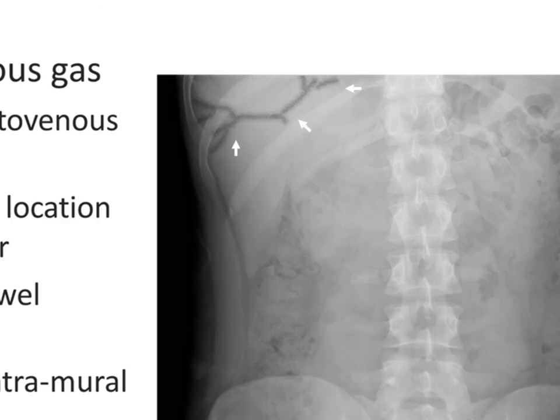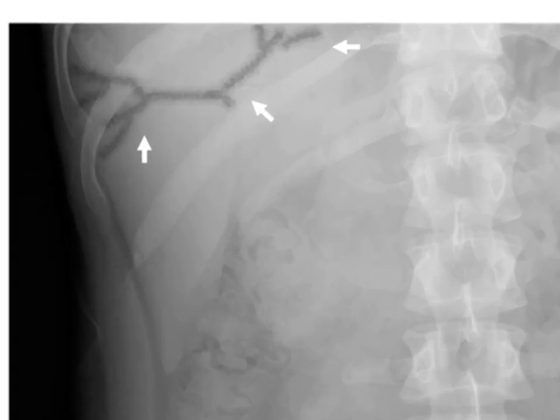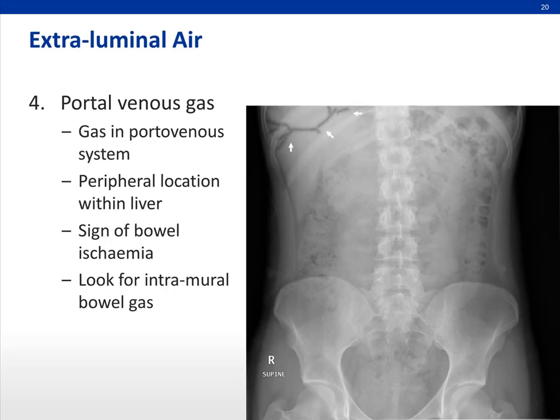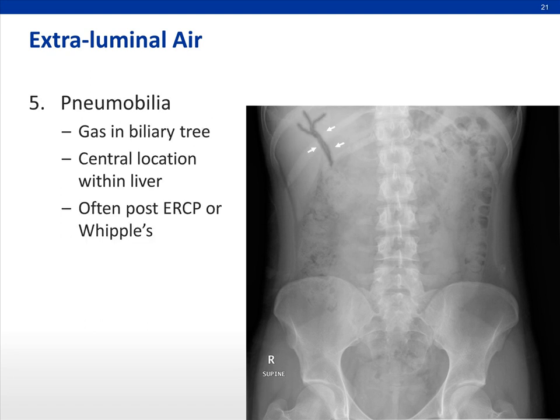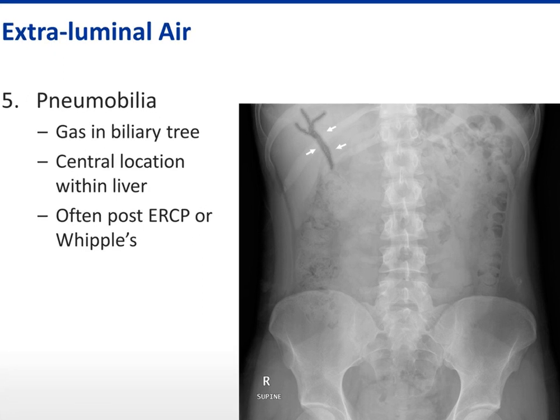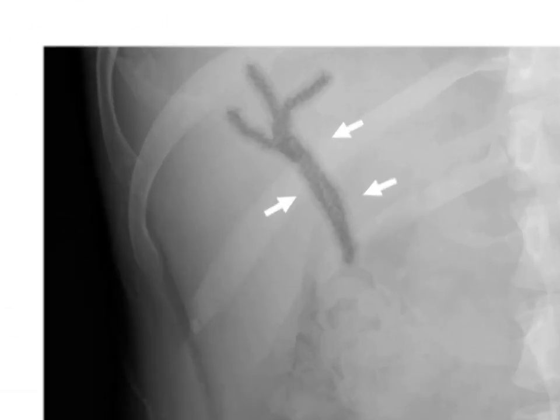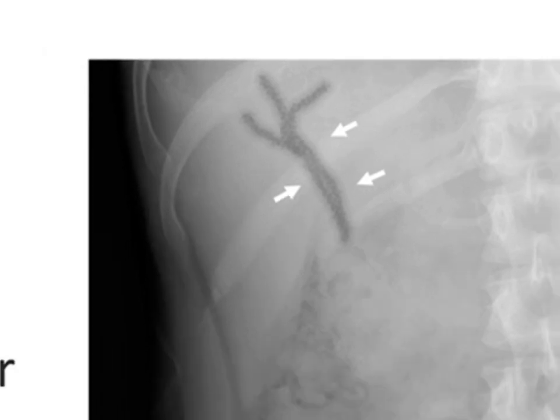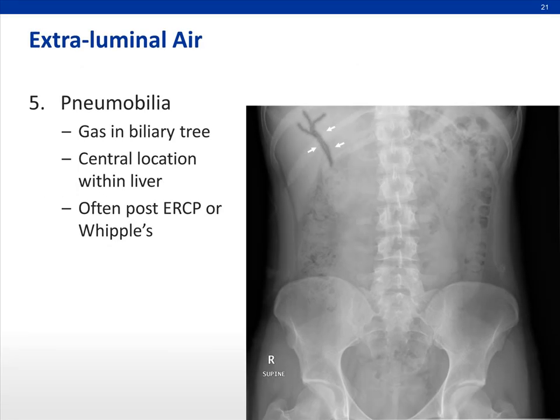Next, we have portal venous gas — tubular gas-like lucencies with a branching pattern extending all the way out to the periphery within the liver. This is a sign of bowel ischemia. It can be mistaken for pneumobilia, which is gas within the biliary tree, as both appear as tubular branching gas lucencies. However, pneumobilia is usually central in location, as opposed to portal venous gas which extends out to the periphery.